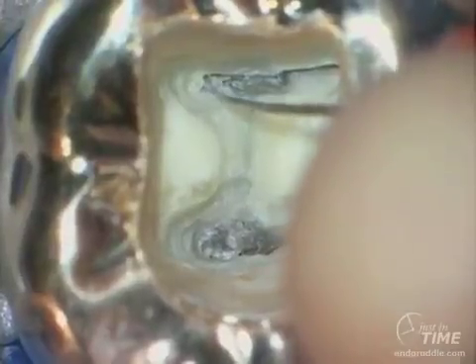In this instance, you can see a thin file is bringing up a small denticle so we can make room for the Gates-Glidden to pre-flare the orifice. By rolling the handpiece in a big orbital arc above the Gates-Glidden orifice pivot point, we can pre-flare that orifice and ramp it out so that it is married to the axial walls — this will give us a smooth entry pattern during subsequent instrumentation.